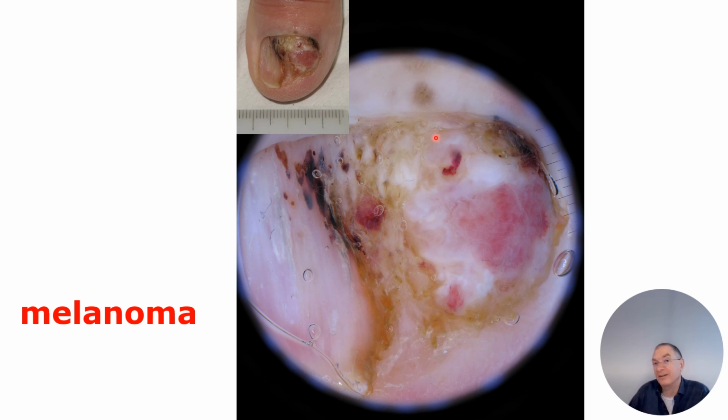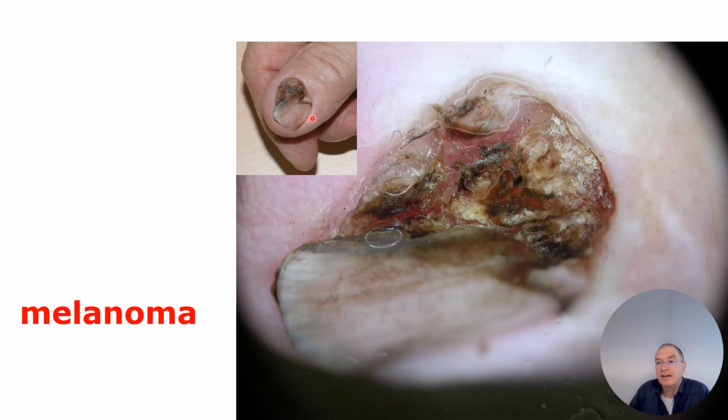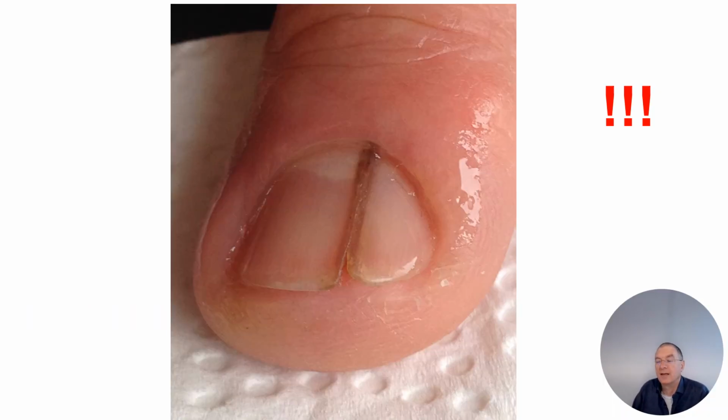So it could be melanocytic, yes, so I must rule out the melanoma with this polymorphism of vessels, and I must rule out the malignancy. Also, this is not an onychomycosis. There may be an onychomycosis in addition, but there's a tumor. Which tumor? I don't know. I must do the punch biopsy or excision or whatever else. I need histopathology: invasive melanoma.